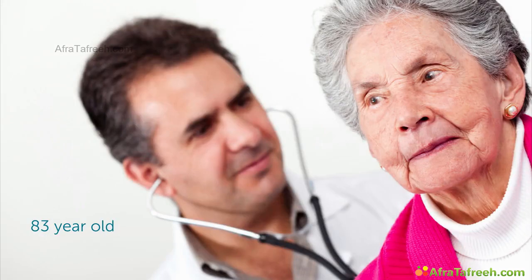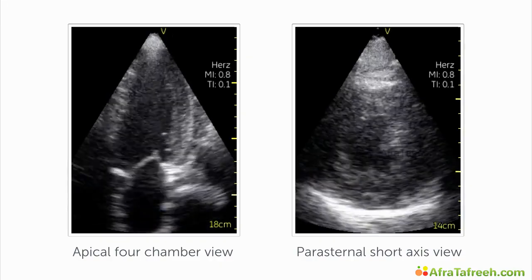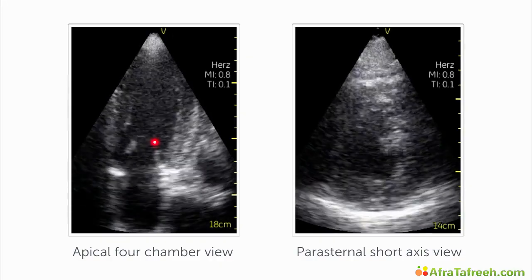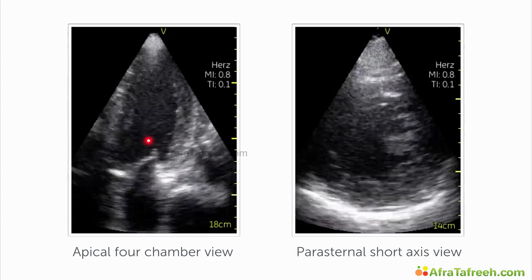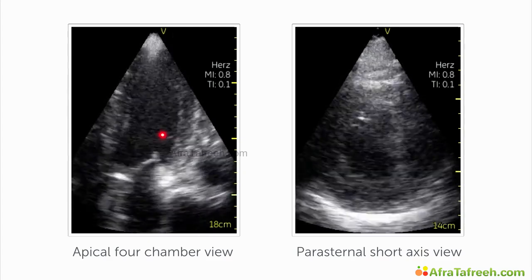Here's an 83-year-old woman who comes with a history of hypertension, and she complains of a drop in exercise capacity. You perform an echocardiogram. Here is the 4-chamber view, and you will immediately recognize that left ventricle function is not only normal, but even hyperdynamic.